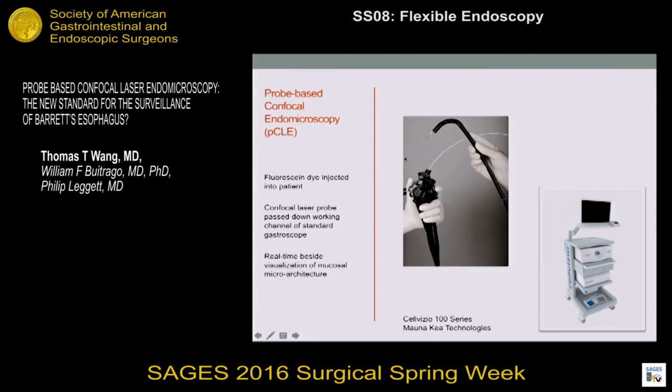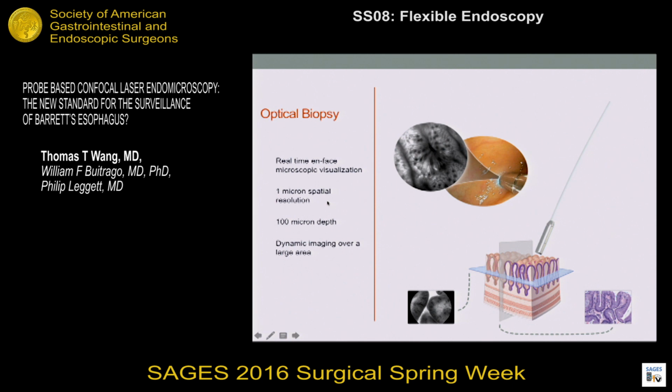The modality that I'm presenting today is probe-based confocal laser endomicroscopy, which I'm going to refer to as PCLE. To give a brief background of how the technology works, there is a confocal probe that passes down the working channel of a standard endoscope, and the probe emits a laser light that illuminates the fluorescein dye that is injected into the patient. What this does is give you real-time bedside visualization of the microscopic architecture of the mucosal surfaces. This is referred to as an optical biopsy.